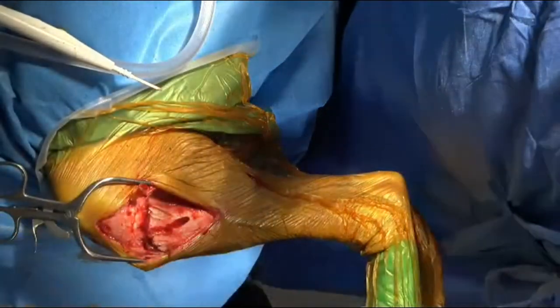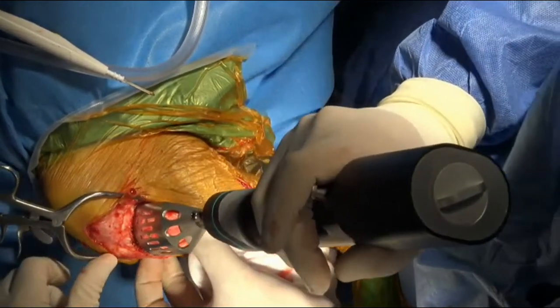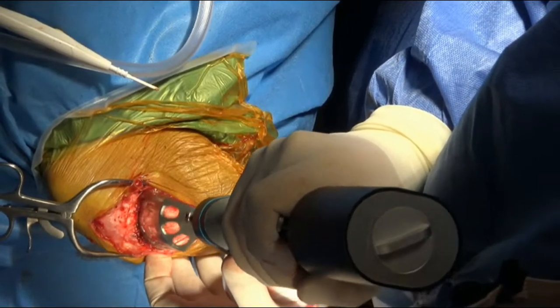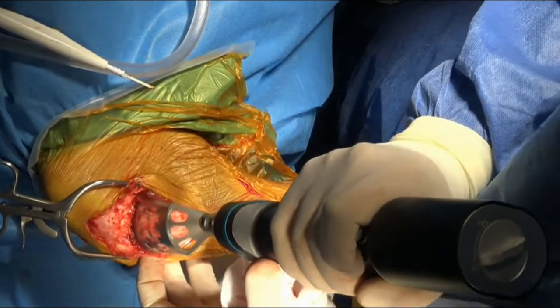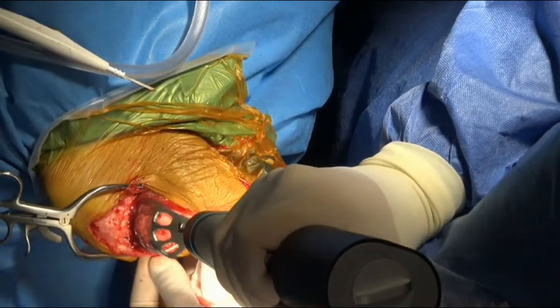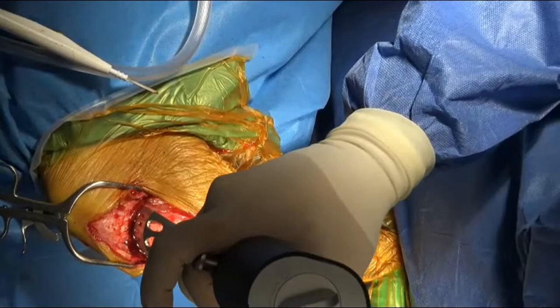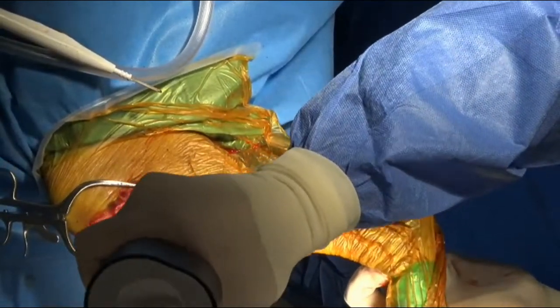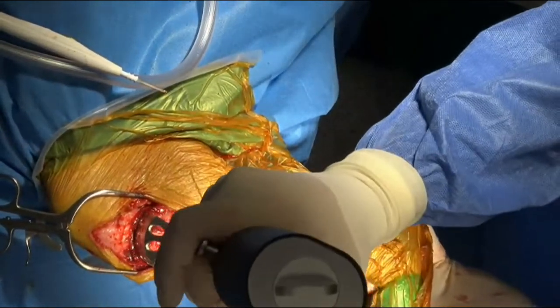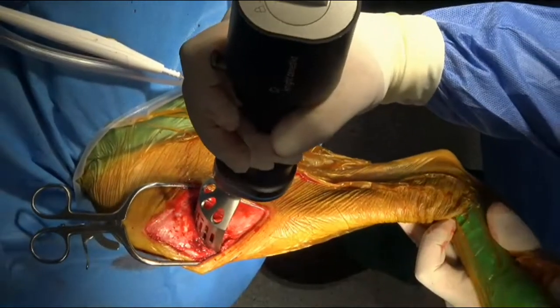So just getting this saw started. I'm starting the saw on a bit of an angle to get it seated, and then we're going to have to straighten up. Does that look good? I'm just going to grab that from you. Good there?